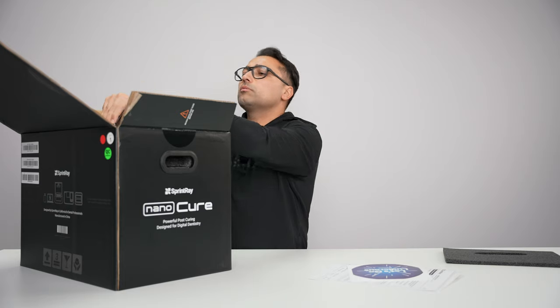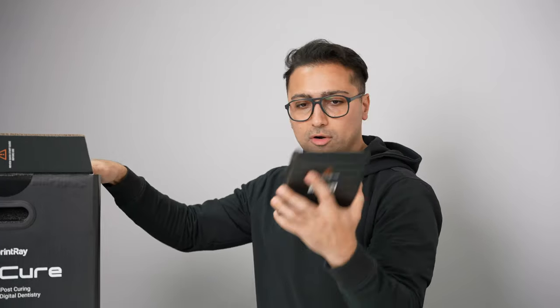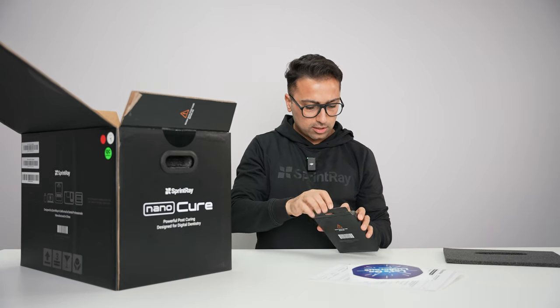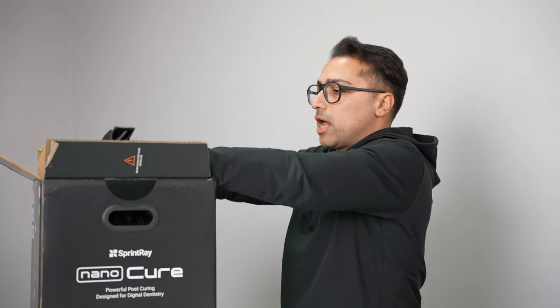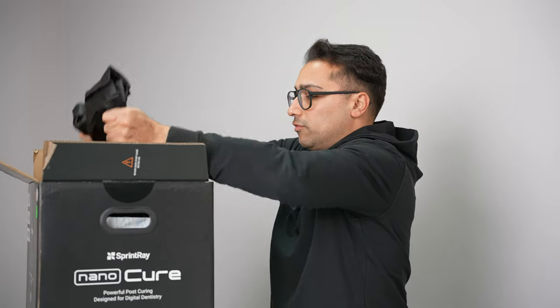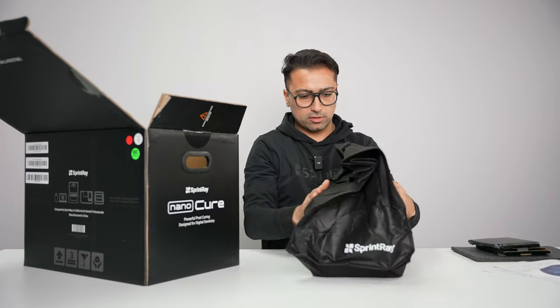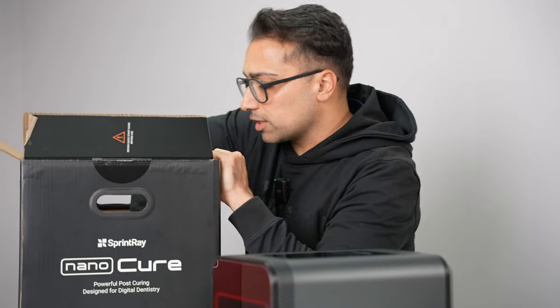Before we go into the machine itself, you're gonna find the curing tray glass sitting right above. Don't forget this. The actual curing glass is sitting right inside of this, inside this plastic bag. NanoCure is sitting in a bag, and you just have to remove it like that from the packaging. Sprint Tray NanoCure. There's the accessory box.